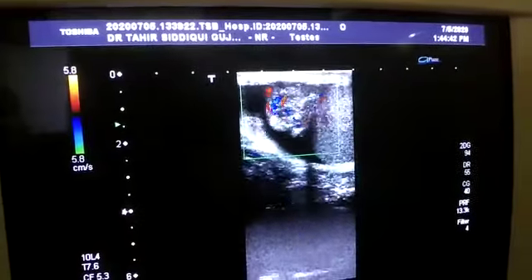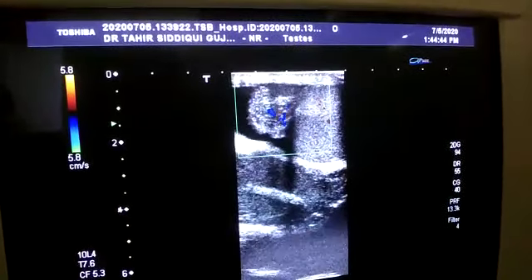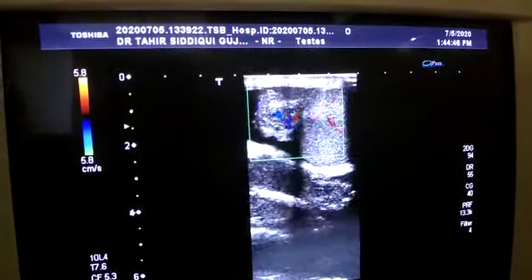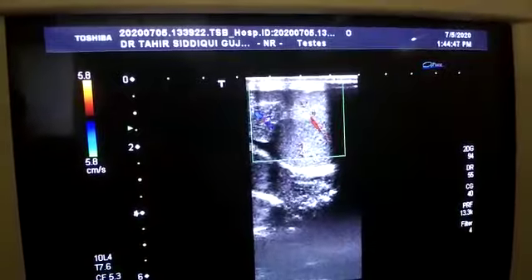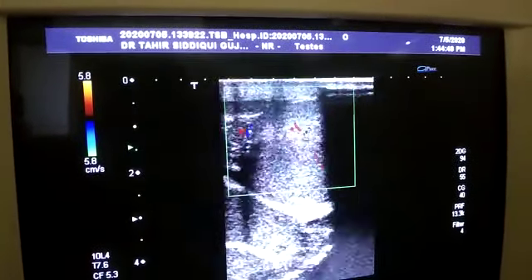This is the ultrasound of the scrotal sac. We are seeing the left testis.